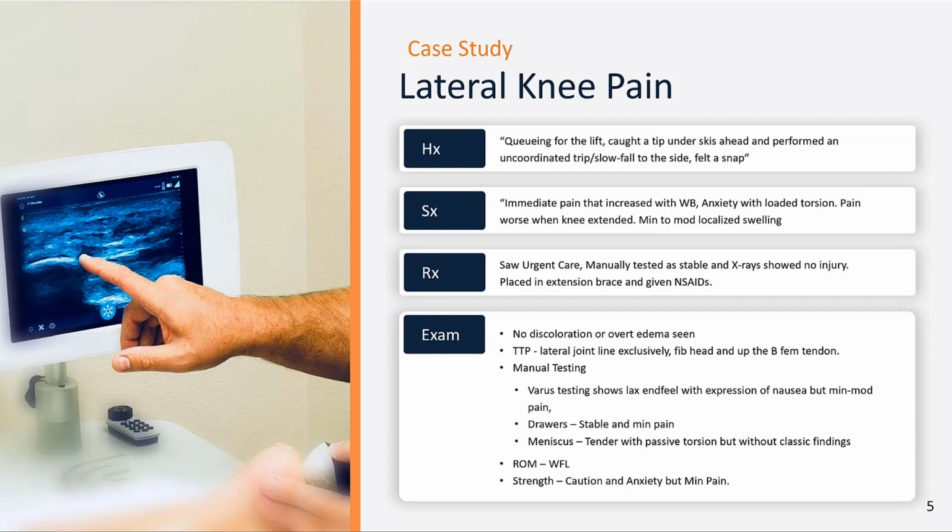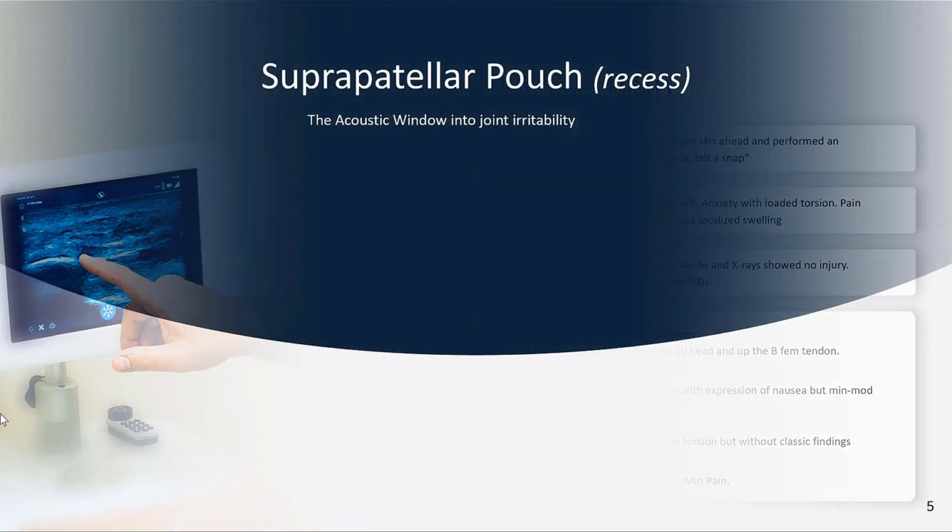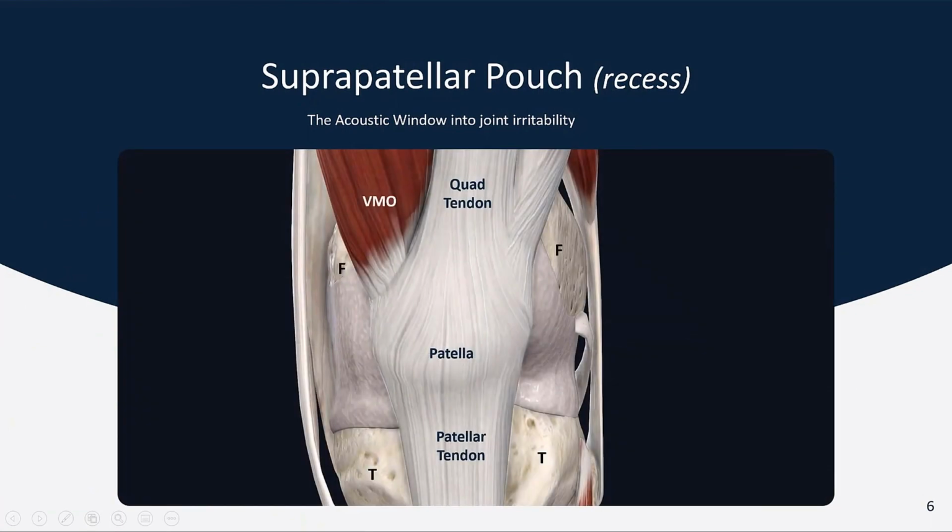So I would like to start with orienting you to the anatomy of the knee without the skin on it, and as you know, the kneecap is going to be located just below the quad tendon and above the patellar tendon. But on either side, this structure in here and off to the lateral aspect here, that's part of the capsule that we're able to see.